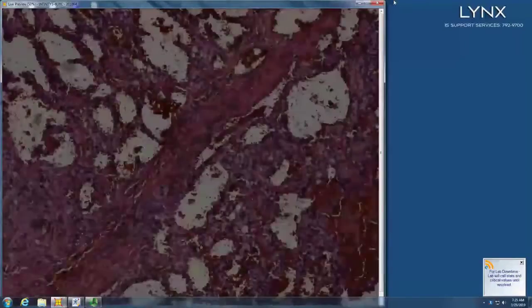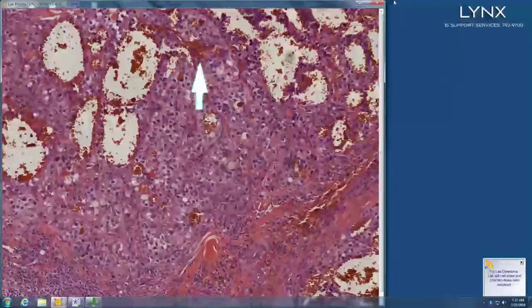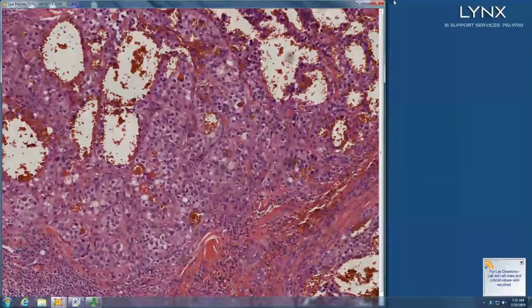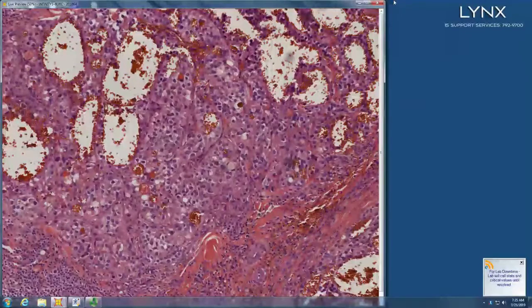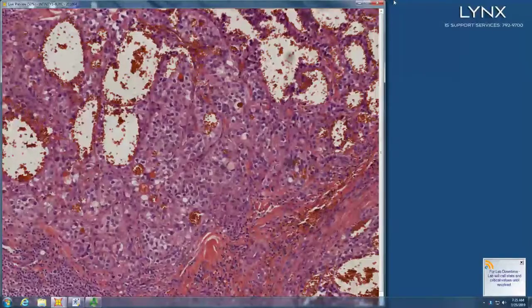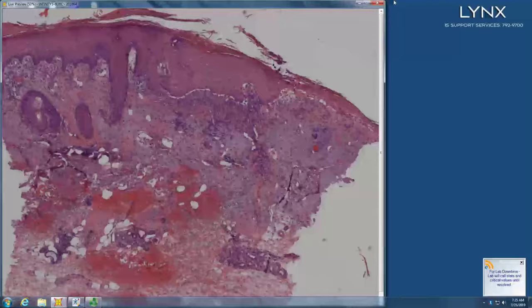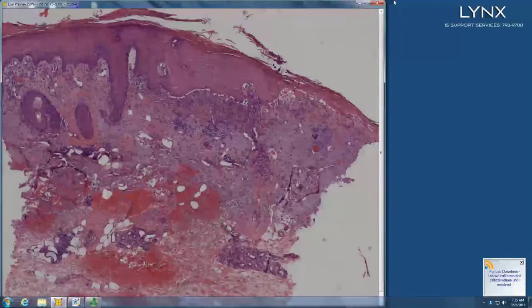Renal. It's renal carcinoma with the tubules there, and just the blood vessels have kind of squashed all the renal tubules out, so it is a simulant of hemangioma, but it's just a very, very bloody renal met. So continuing the theme of things that look like other things, right? You just have to know what your simulants and pitfalls are.